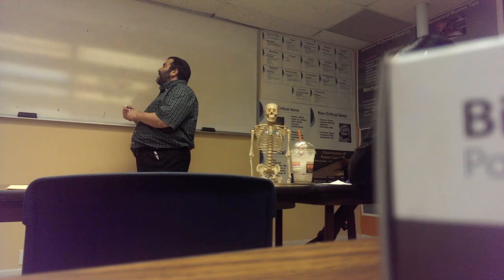I have a question. The wires on the table, near the machine, say C1, C2. Instead of V, they put letter C for chest. Yes, same thing. It makes no difference. V, C, whatever, as long as it says 1, 2, 3, 4, 5, 6.